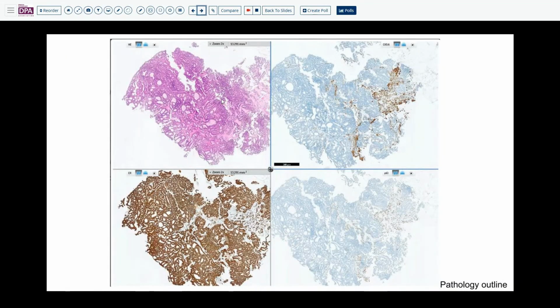And then this one is a little bit different. We have this papillary lesion, and we have CK5/6 and P63. They only highlight this normal gland here. So we have a myoepithelial layer in this area, but it is lost in most of this papillary lesion here. And then the ER also shows diffuse and strong staining.